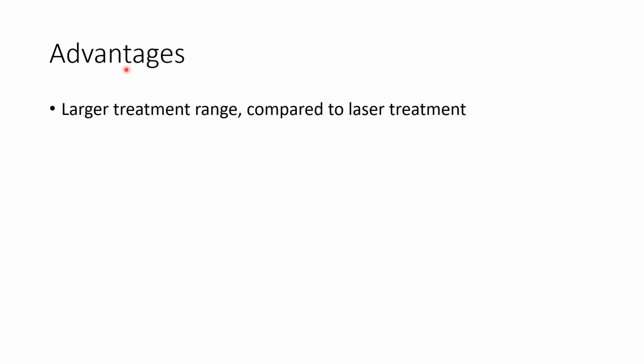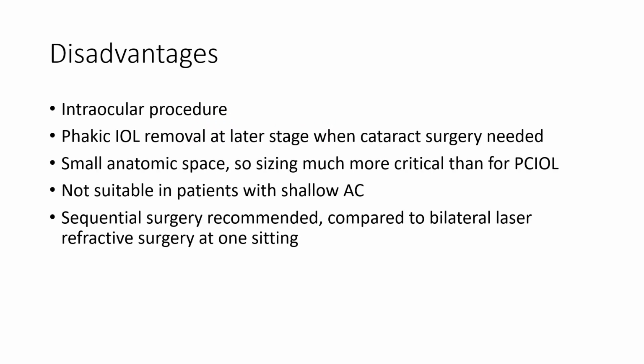Coming to the advantages of phakic IOLs, they have a larger treatment range compared to laser treatment. Now let us discuss the disadvantages of phakic IOLs. Phakic IOL is an intraocular procedure, whereas laser refractive surgeries are not intraocular procedures. Phakic IOL removal should be done at a later stage when cataract surgery is needed.